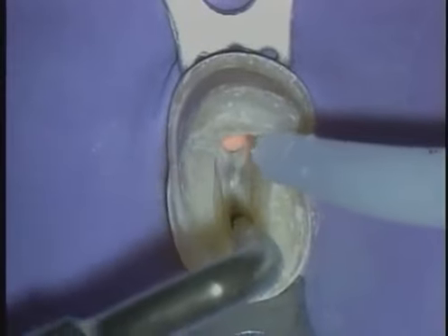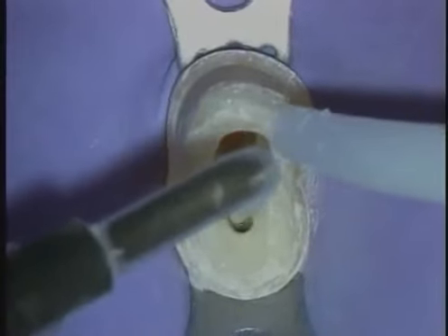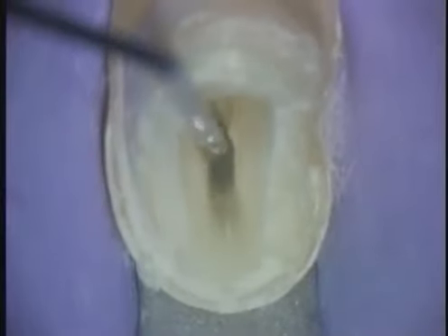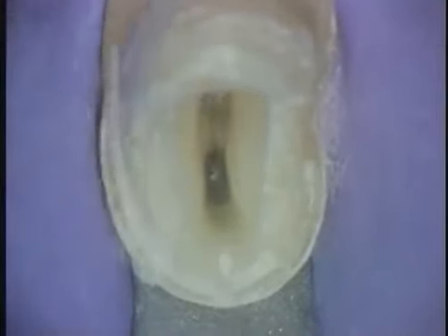It's very useful to work dry. Assistants can blow air and it's collimated into the tooth so that at all times debris and dust is liberated from the chamber. This allows us to have a continuous line of sight into the area where we're working. I like to use Gates Gliddens on those little small orifices and face off the orifice so there's a great smooth transition down that axial wall from the incisal reference point into the pulp chamber space.